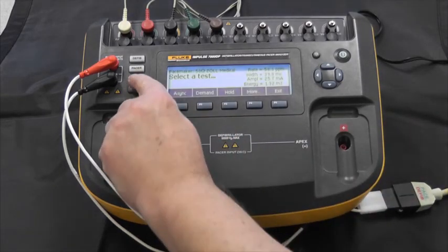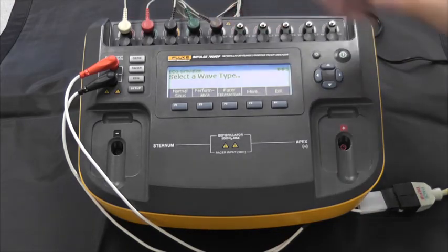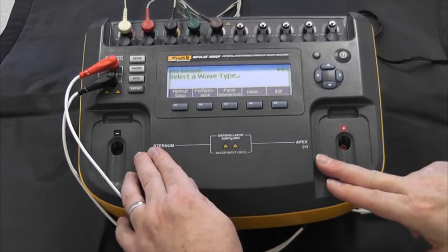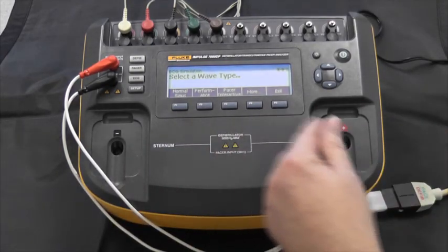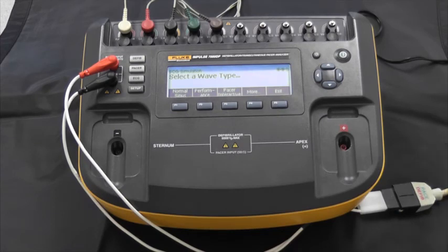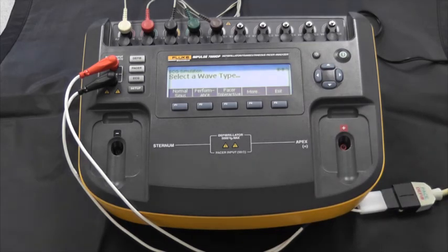ECG waveforms — these are simulated waveforms delivered through the lead wires and also through the pads or paddles connections. We have a variety of different categories of wave shapes that can be displayed and sent to the patient monitor part of the defibrillator. This is important when you're going to do AED testing. You can select a whole lot of different arrhythmia waveforms — we're not going to go into all of them right now.